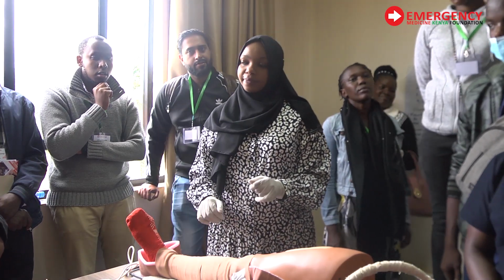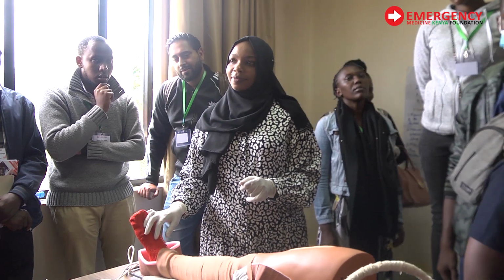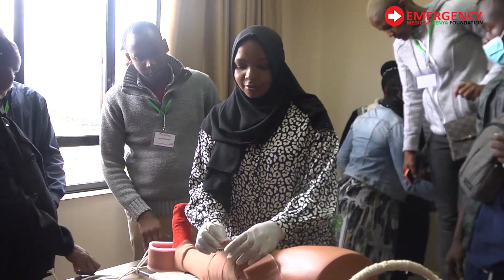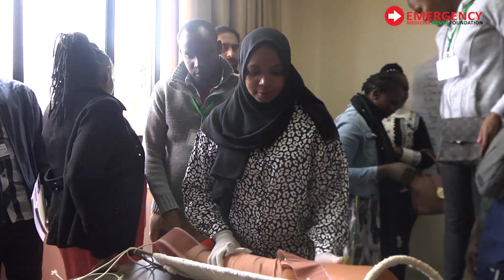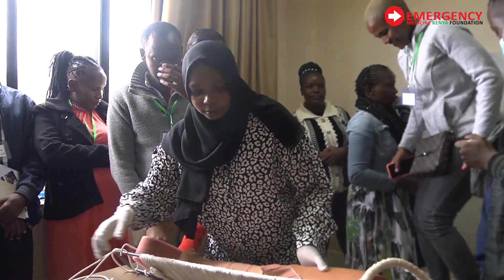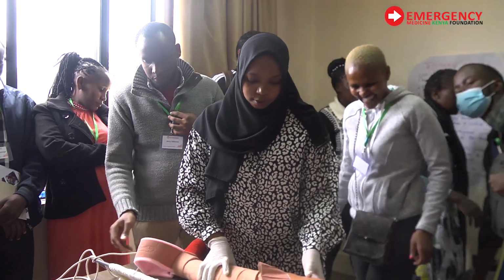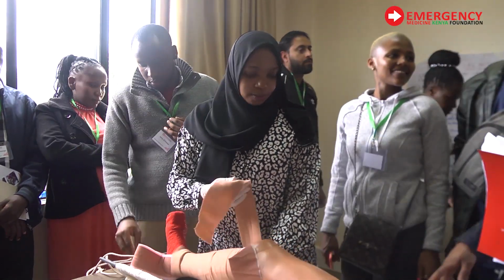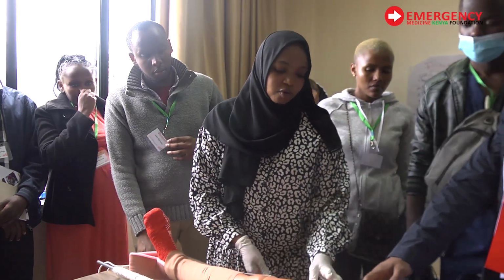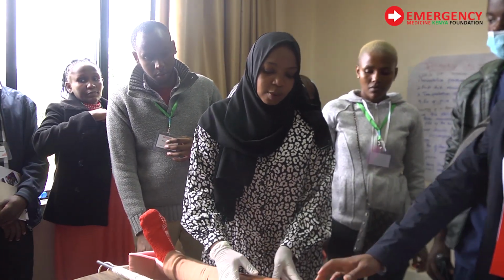So you want to try? And then the bandage, will it go up to the knee or above? No, it's just above the knee, not where the injury site is. It's just to help with the traction.